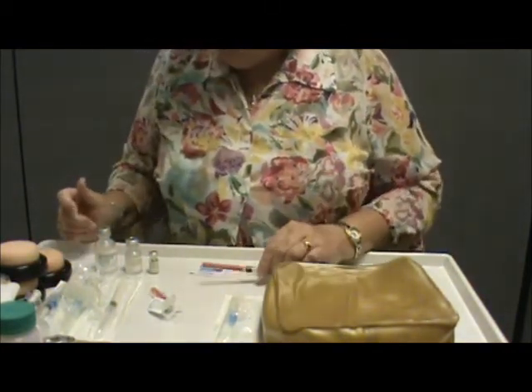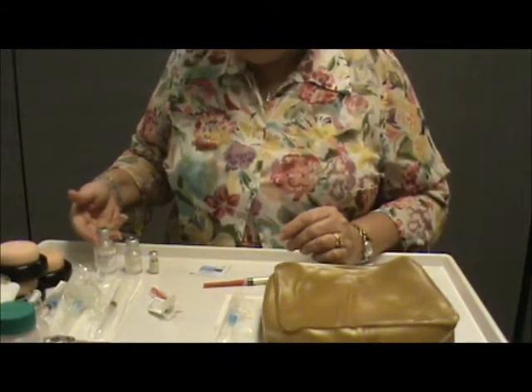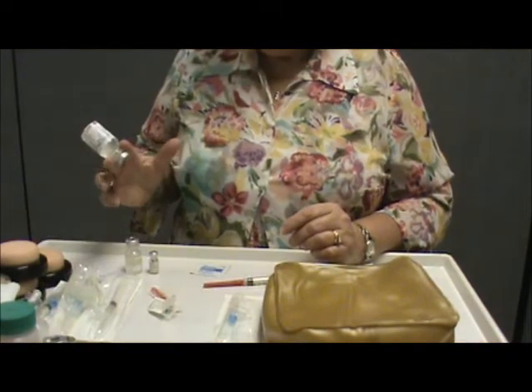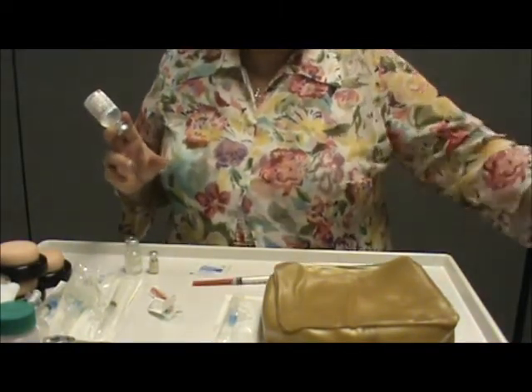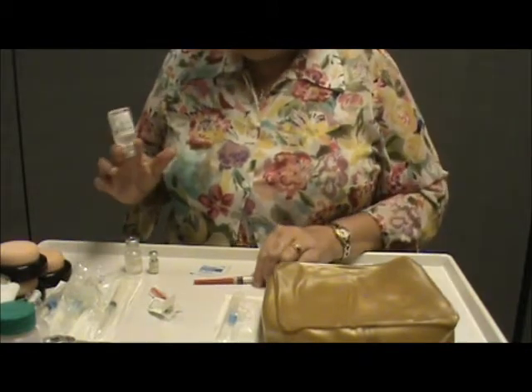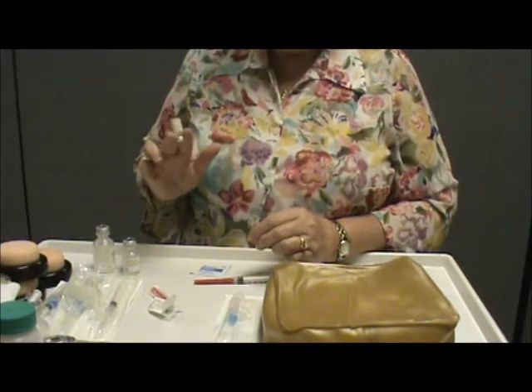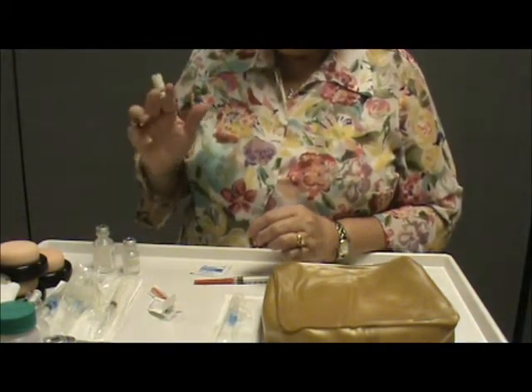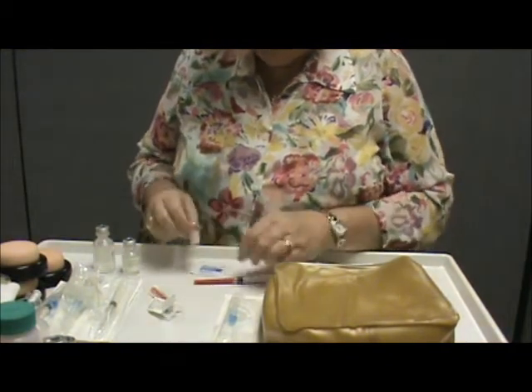I'm going to withdraw from a vial. Always remember, when you're holding a vial, you want to hold it by the neck so that when I'm withdrawing, I want to hold it by the neck. Then it doesn't matter what size I have. I can easily manage a single dose vial to a multi-dose vial, and I'm comfortable with it.